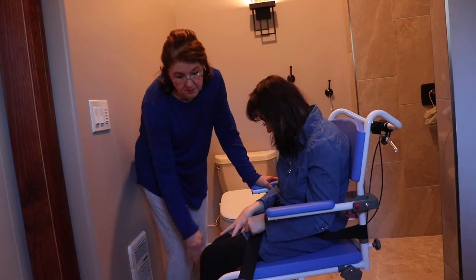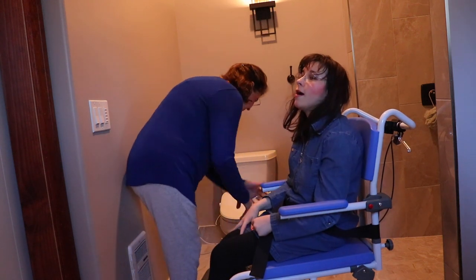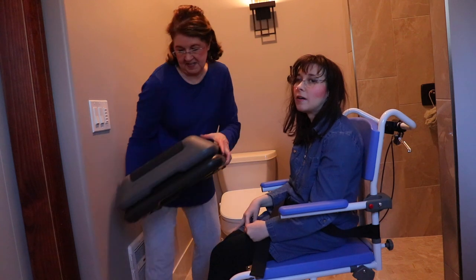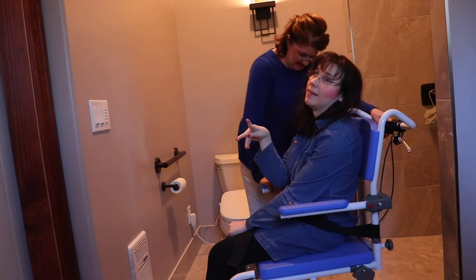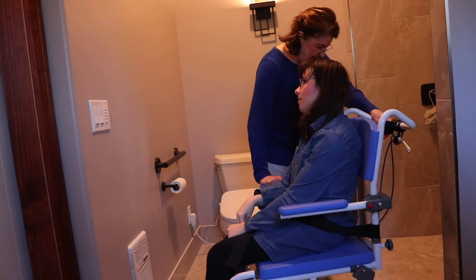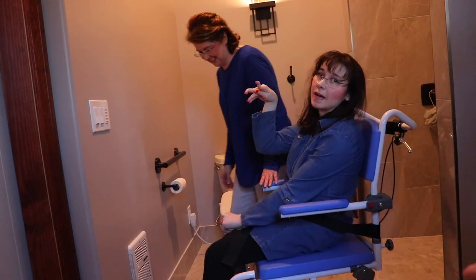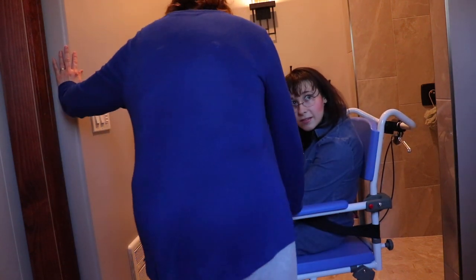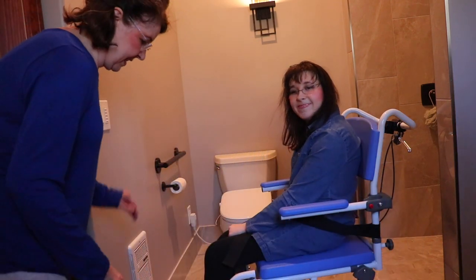This is a nice spot — she's usually sitting by the wall heater here. One more brake to get in here — there we go, that's where it's at. Okay, so now I'm going to bring this forward, just a bit, and position it as close as I can.